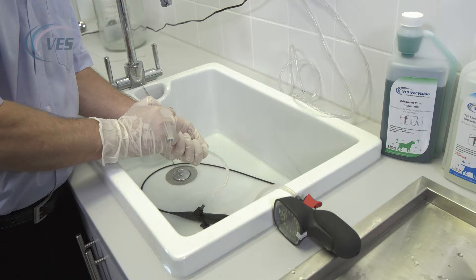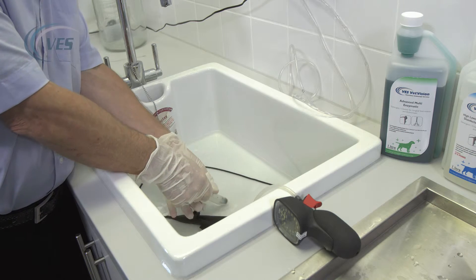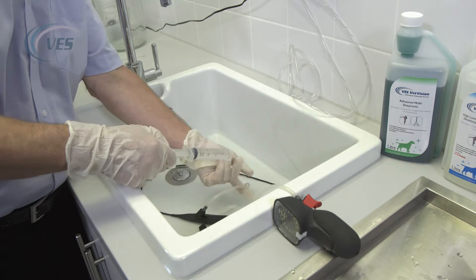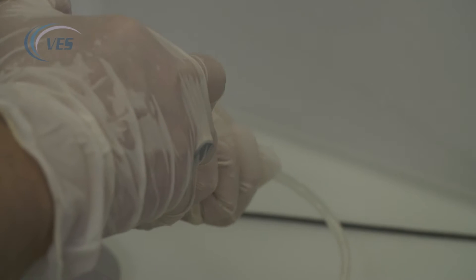Ideally, we could do this two or three times, until all we get is a steady stream of fluid as opposed to bubbles. Keep an eye on the leak tester — that shouldn't be dropping at all.